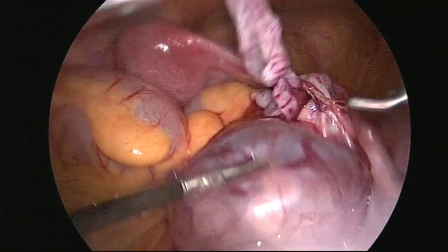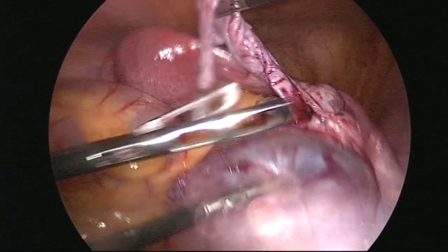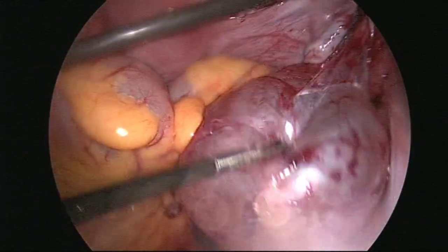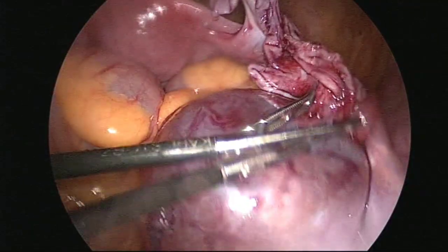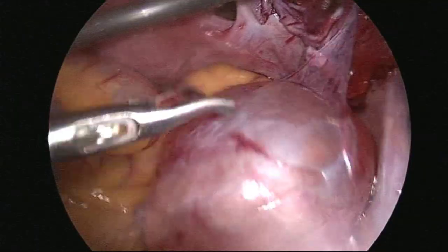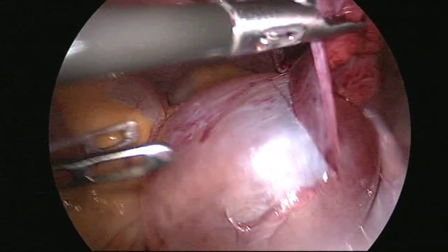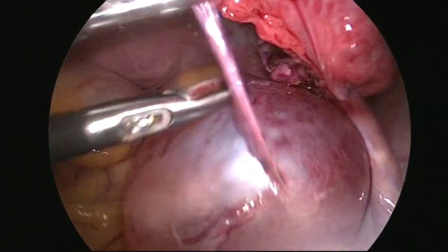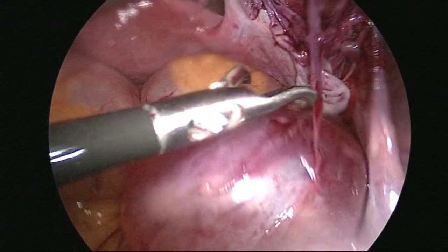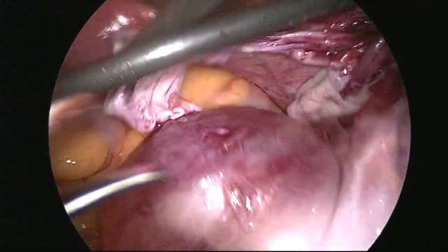Yes, now it's separated. You can see there is healthy ovarian tissue. Whitish ovarian tissue is still present. In the beginning I told that I'll try to protect it, to preserve it. That is preserved. This is the last fiber. And the cyst is separated completely without rupture. A big achievement for me. You can see behind this there is healthy, whitish ovarian tissue, this one.